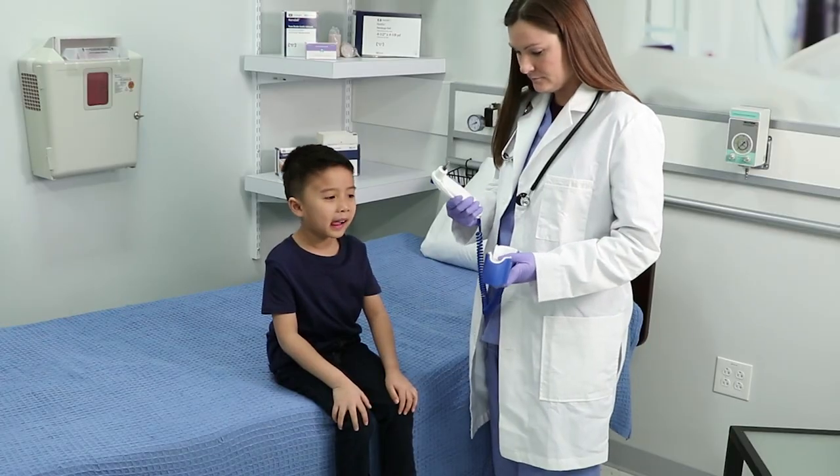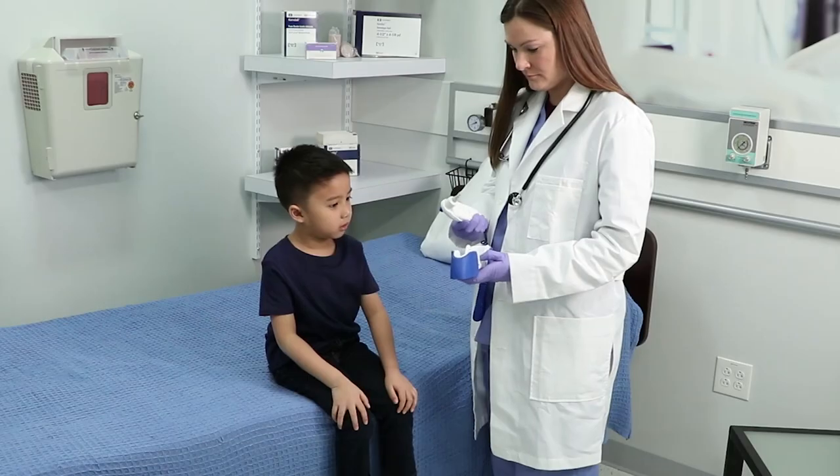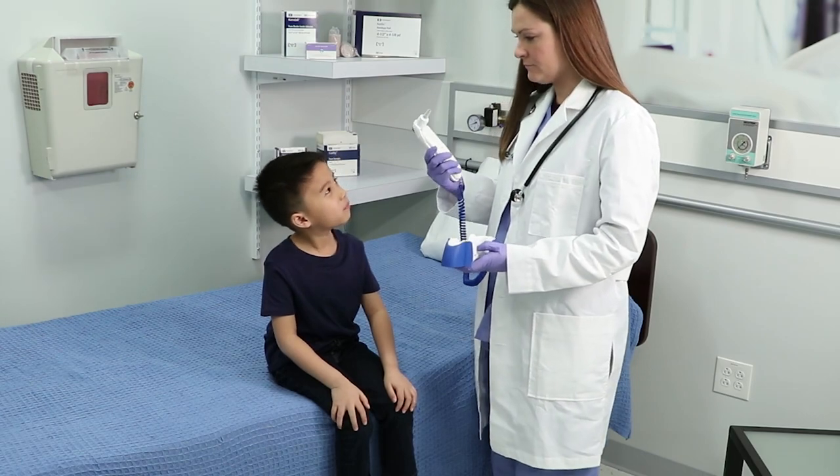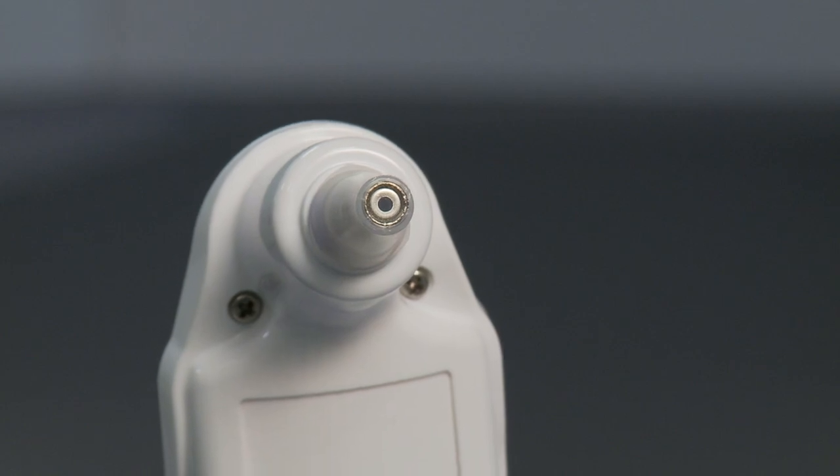Install a probe cover by firmly inserting the probe tip into a probe cover. Inspect the probe cover to make sure it is fully seated and no holes, tears, or wrinkles are present in the plastic film.